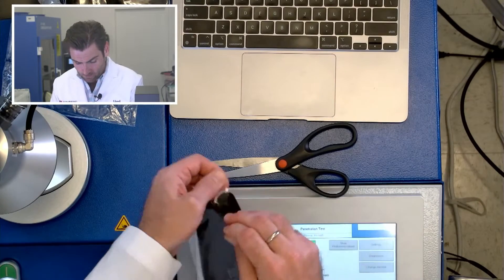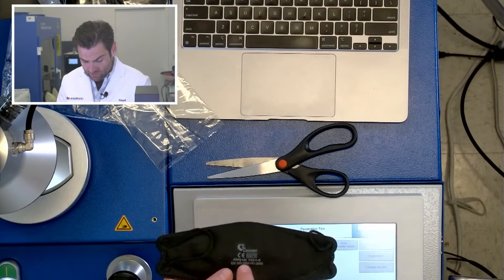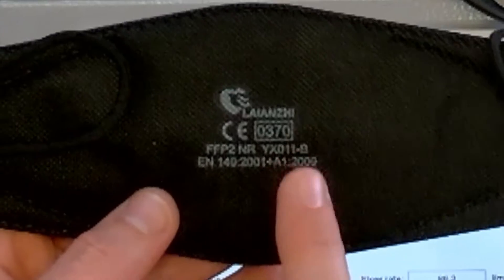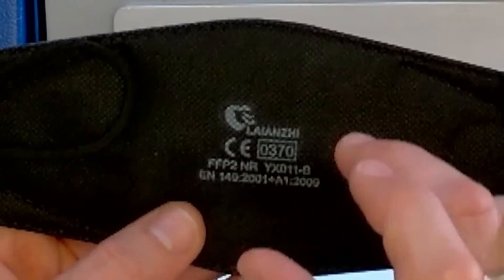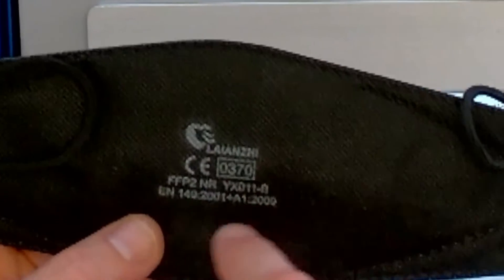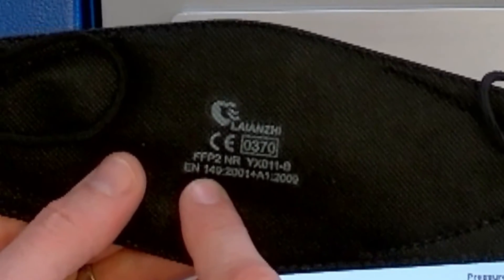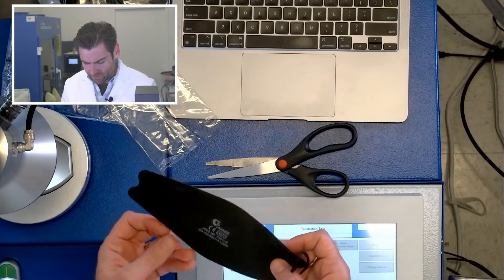It's a KF94 style — well, actually this is the FFP2 standard, and you'll notice again if something has a standard, it's going to say it right on the mask. By the way, I don't know how they do this ink. We looked at every ink available to try to print on black spunbond and couldn't figure it out. So this is amazing — great registration, good ink. EN 149 FFP2, so that's basically the European N95.